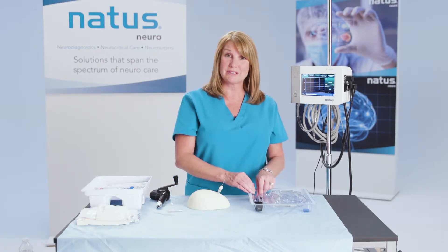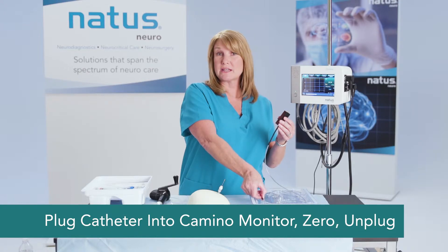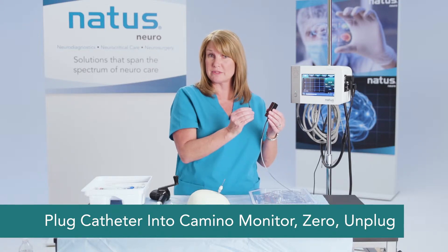Now we want to zero the catheter, and you'll do that using your zeroing tool, just as you would with any of the other fiber optic catheters.